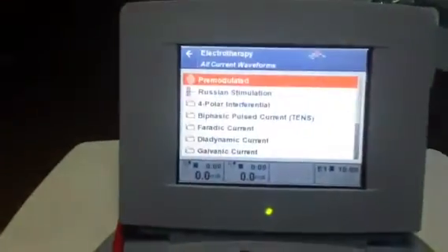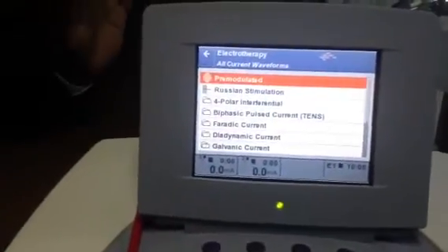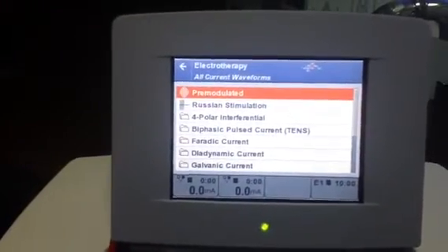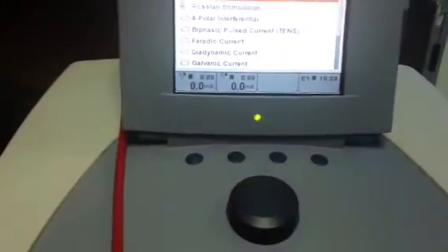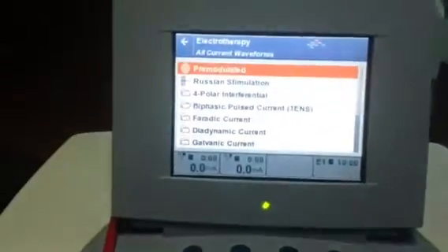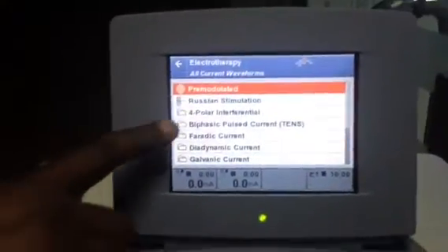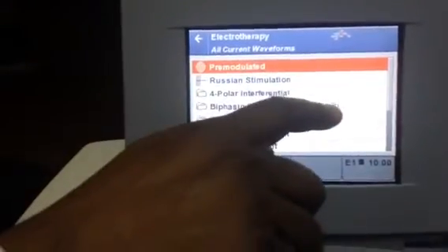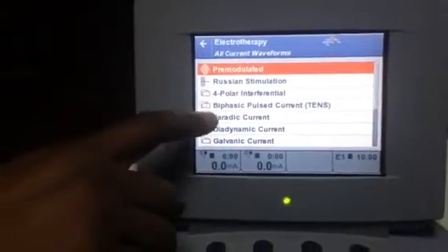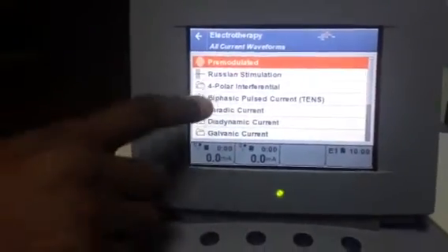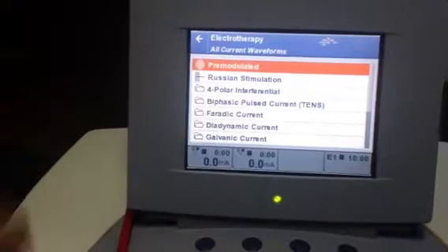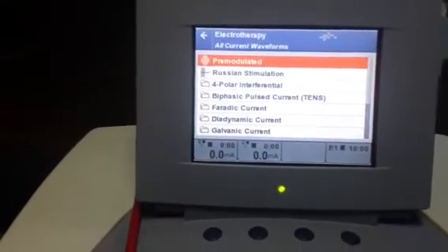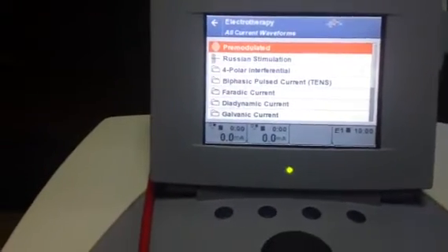Go back again. All Current Waveforms means whatever currents are available in this machine — both for pain and for stimulation — will all be displayed here. Try to remember these currents: Russian current, Interferential current, TENS current, Faradic, Diadynamic, and Galvanic. These are the different currents you are going to apply to patients.